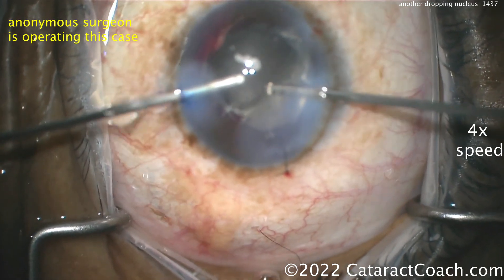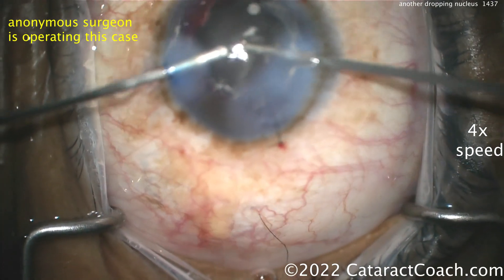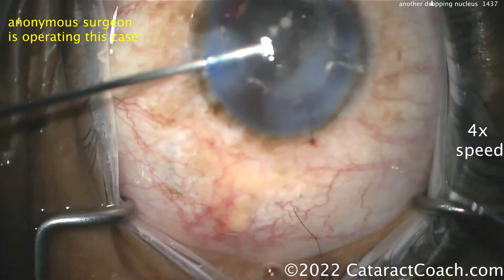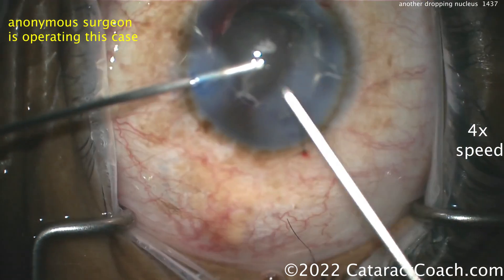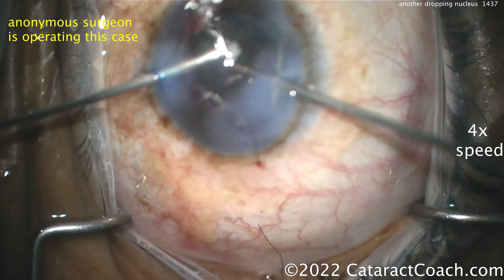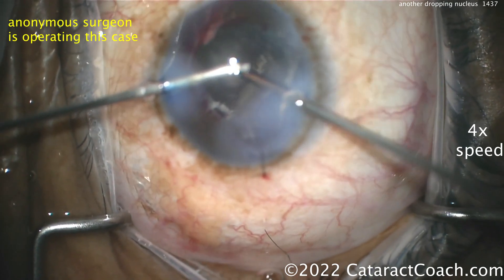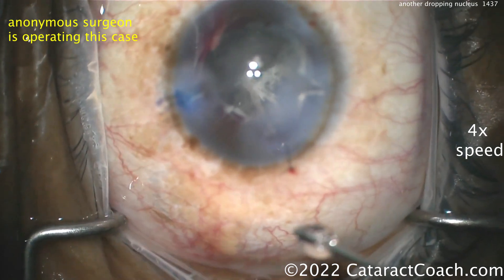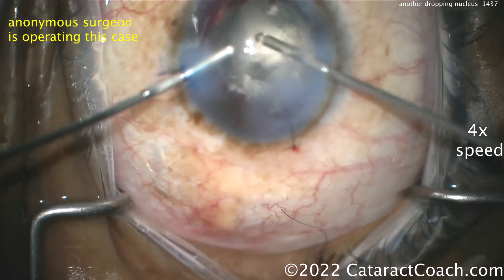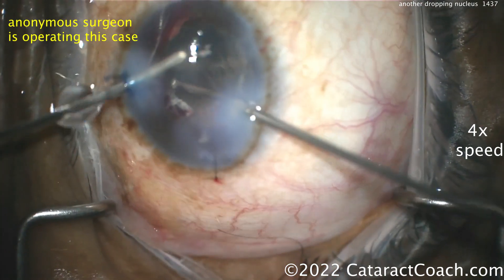Your vitreoretinal colleague will clean that up for you. The patient will get a full pars plana vitrectomy and pars plana lensectomy — it'll be fine. You can leave the eye aphakic for now. Your vitreous colleagues can clean up everything: the prolapsed vitreous, remove the nucleus, ensure the retina is totally attached, and they can put the lens in too. Let them know what you want. This case should have reasonable zonular support for a sulcus lens.